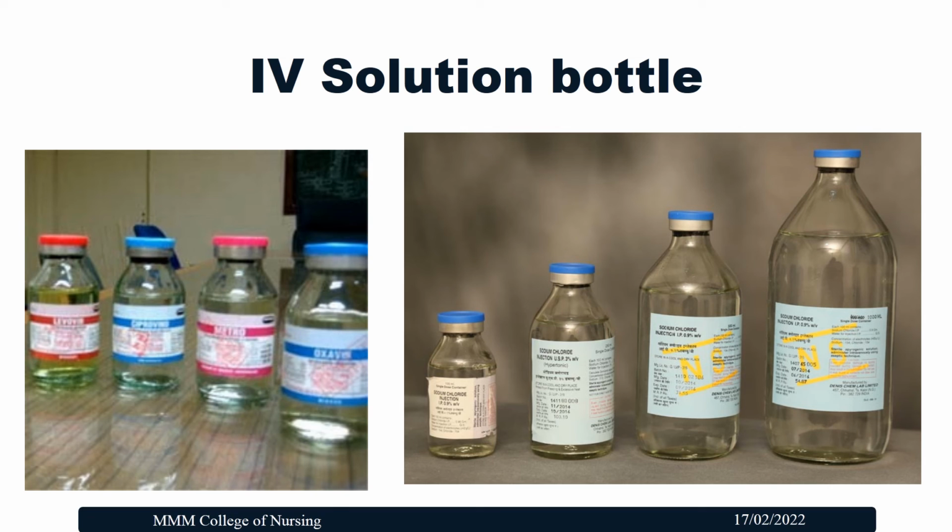IV bottles are sterile glass containers which are filled with sterile medication or IV solutions. During the infusion it cannot collapse, so definitely it needs an air vent. As we are using the air vent, there is a risk of infection.